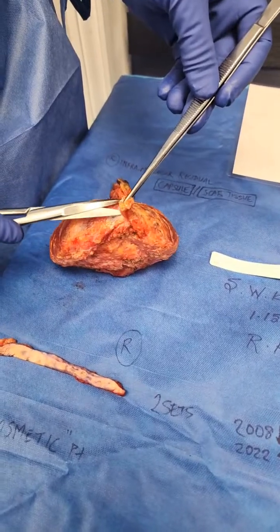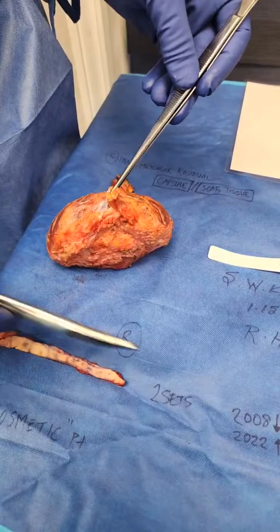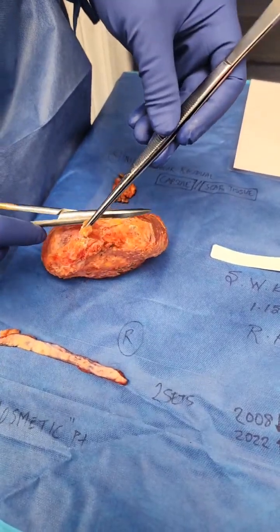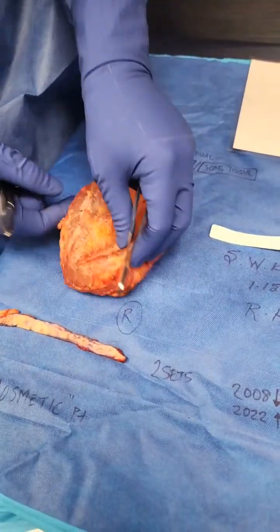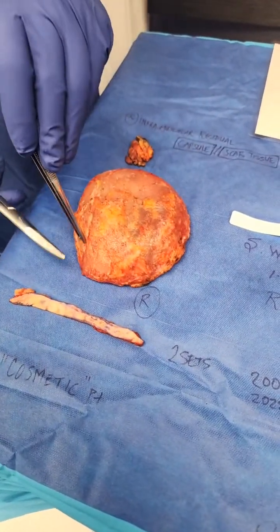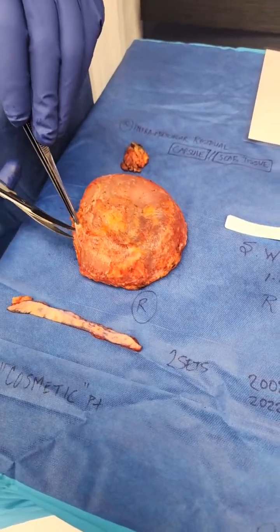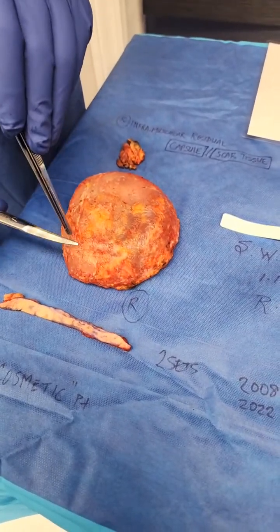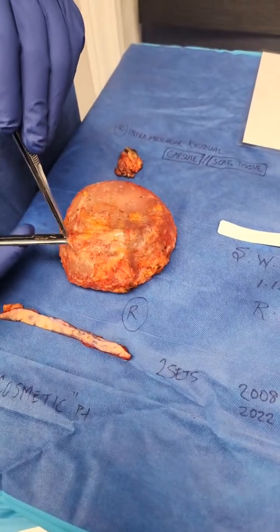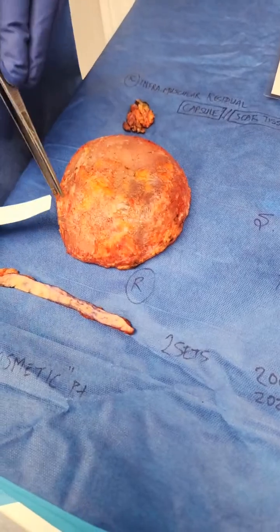So as I go in here, remember, this cannot be ruptured because this is just from 2022. So the goal here is to remove all of that scar tissue. This is done in an en bloc fashion. Remember, this is so thin I can pass my scissors through, and you can see how thin it is. Let me actually go ahead and get this to show how thin this capsule can be.